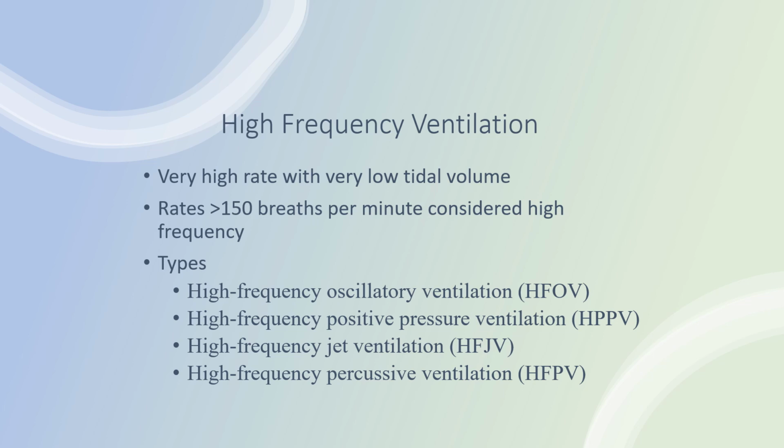High-frequency ventilation is a form of mechanical ventilation that utilizes very high respiratory rates but very small tidal volumes, often smaller than the volume of anatomical dead space. The FDA considers any ventilation mode that provides more than 150 breaths per minute to be high-frequency. There are mainly 4 types of high-frequency ventilators.